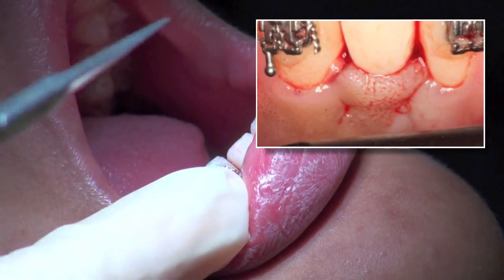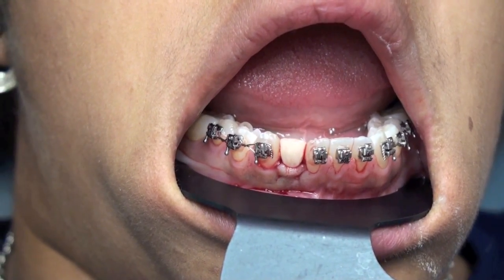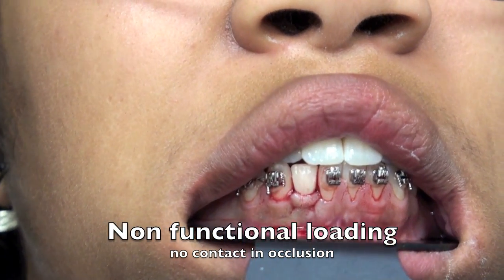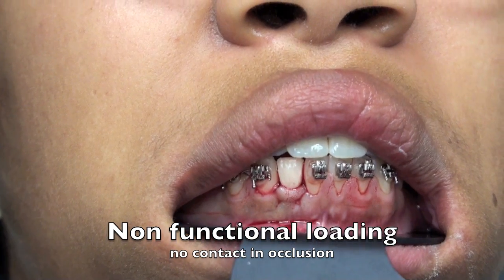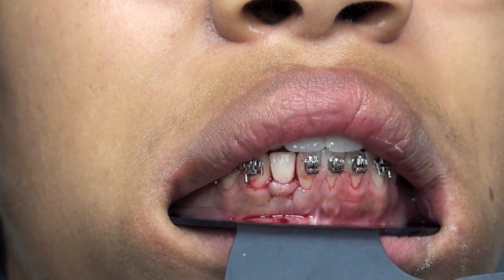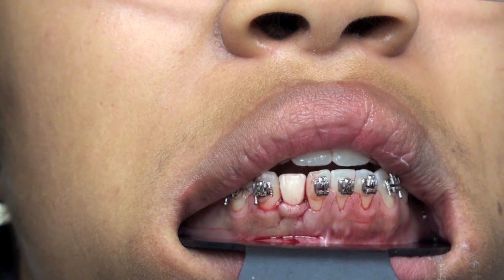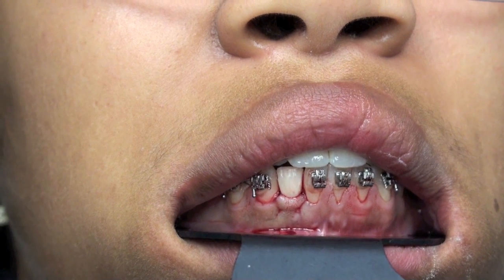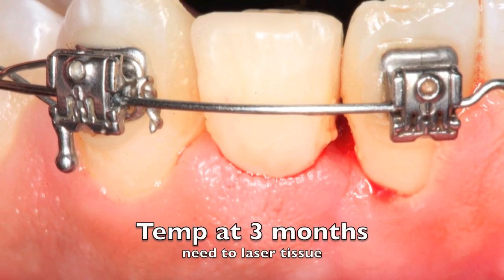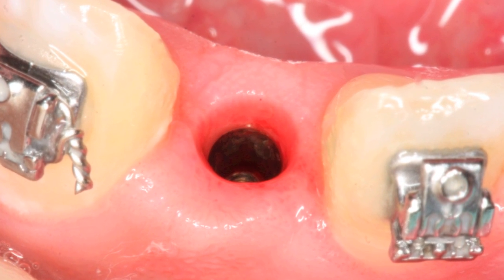This suture will have to be taken out — it is a Cytoplast suture. One of the most important keys to success is having a non-functionally loaded temporary crown: all protrusive, lateral, working, and non-working interferences are removed so that the bolus of food can contact it, but parafunctional forces are eliminated. Here we've got this beautiful crown — the patient is going to come back in about three months, we'll take it off and make a final prosthesis, and the patient will be doing great.